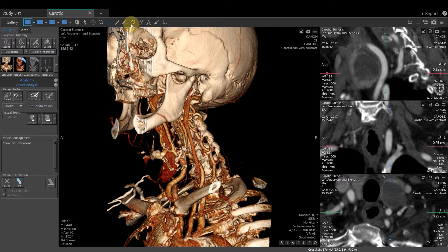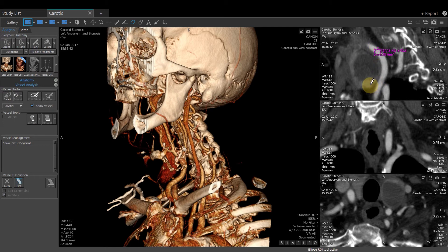You can also use the ellipse tool to define an elliptical region in an area of anatomy. Click and drag to drop the ellipse tool, and to the upper right, we will have the information displayed.